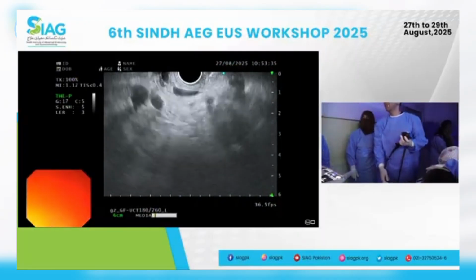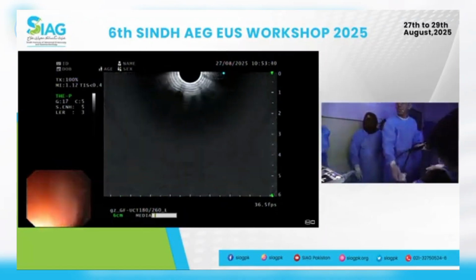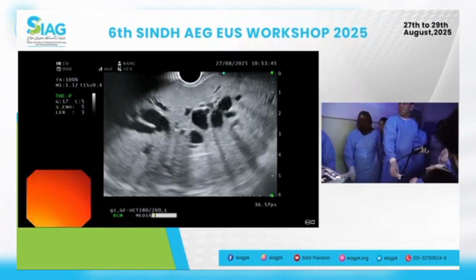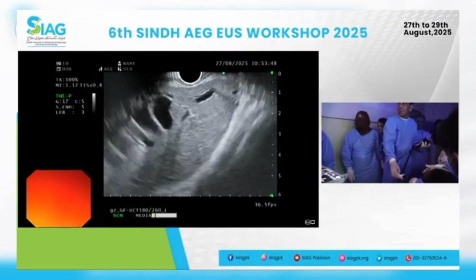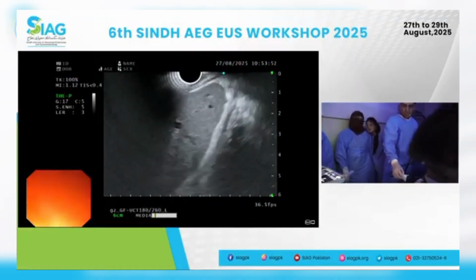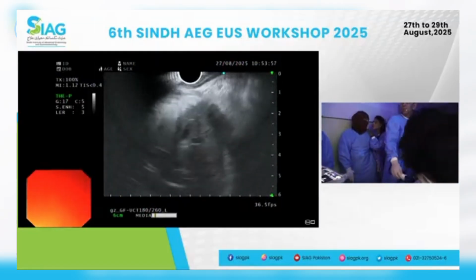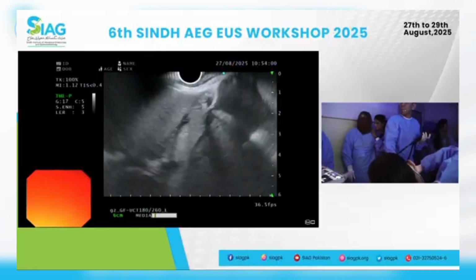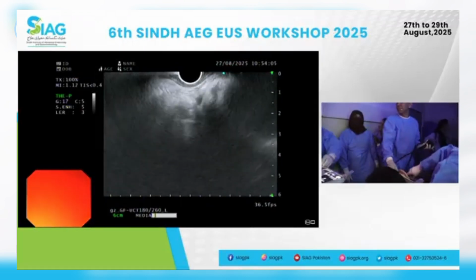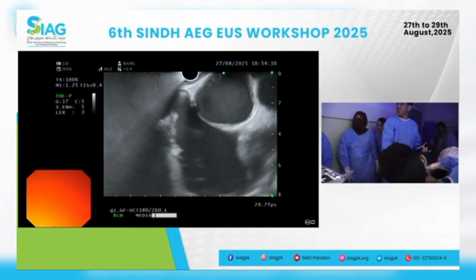I'm falling back, yes. But in the interest of time, we'll go to the mediastinum. मुझे gauze piece दीजिएगा. So all I want to do is come back. We've seen this before. Come to the IVC. तो इसी डेप्थ रिड्यूस कर दीजिएगा प्लीज. हाँ जी, थोड़ा सा और कम कर दीजिएगा.